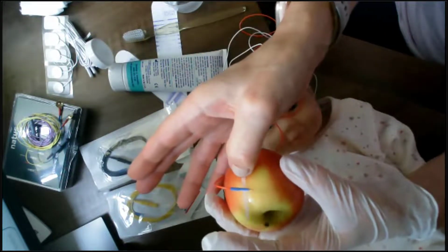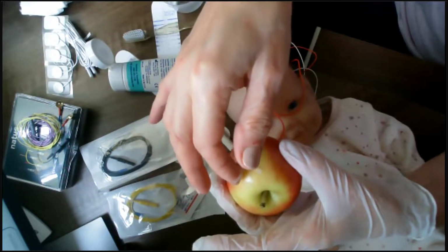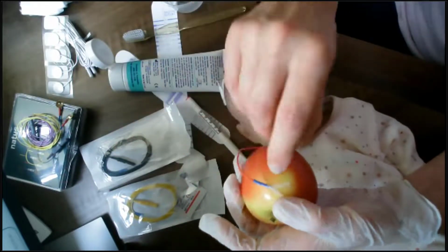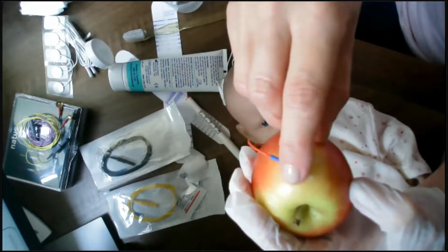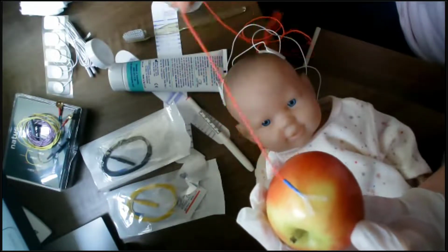So I simply take my steri strip, place it underneath the needle, and in a chevron kind of style, I secure that needle electrode. So I've actually got that steri strip taped around the hub. Can you see there? Taped around the hub. And it's stuck really nicely and firmly. So I can give this a really good pull now.